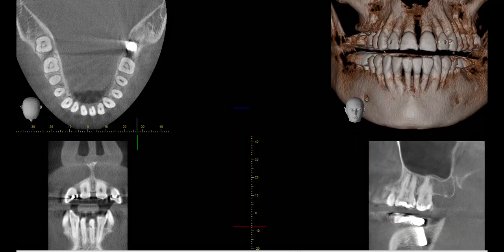As dentists, obtaining profound dental anesthesia is an extremely critical part of our jobs. Patients trust and value a dentist who can get them numb and complete their procedure without experiencing any pain. Over the years, I've come to rely on the CT scan as my co-pilot in this task. By reviewing the tooth's anatomy prior to administering anesthesia, I can learn a lot about where to administer the anesthesia for its most profound effect.